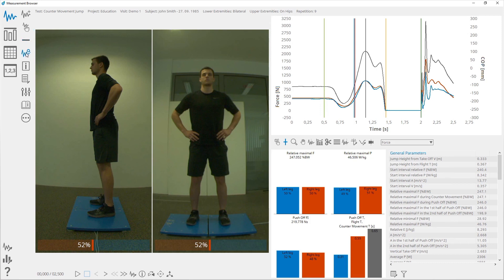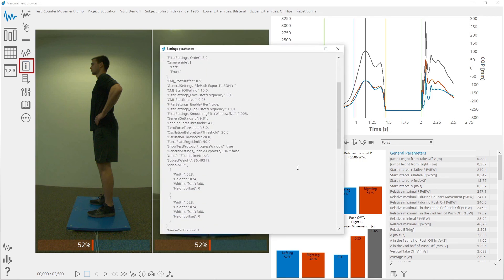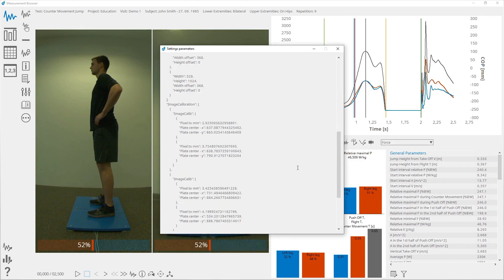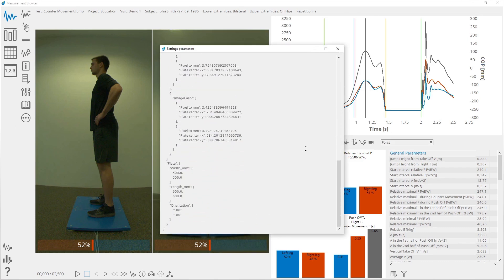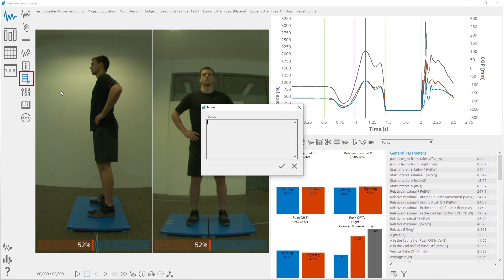Reanalysis of the selected measurement can be done by selecting the Reanalyze button. The reanalysis will be done based on the moved event cursors. By clicking on the Info button you will get additional information about the selected measurement — this info also contains parameters used to analyze the measurement. You can write notes about the specific measurement by clicking on the Notes button.